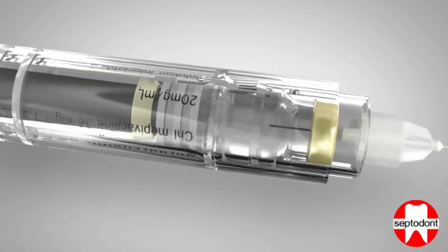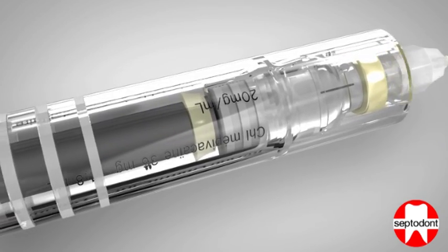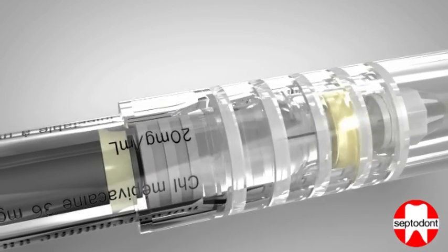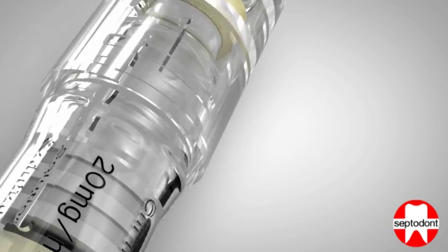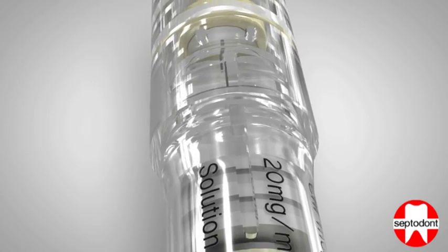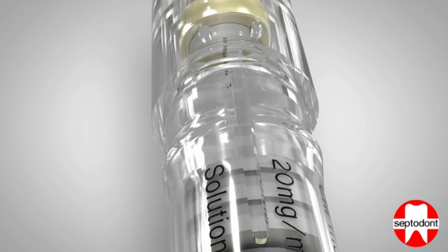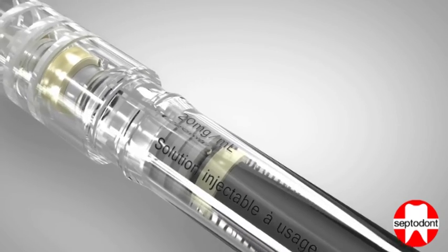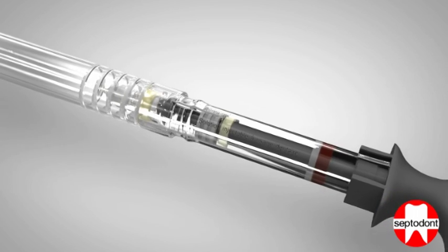After you have finished the injection, remove the fingers from the handle and grip the finger holder. Slide the protective sheath down the barrel of the syringe until you reach the first holding position. Then grip the barrel of the syringe and push the protective sheath firmly until a positive click is felt and heard. The device is now in the final locking position.